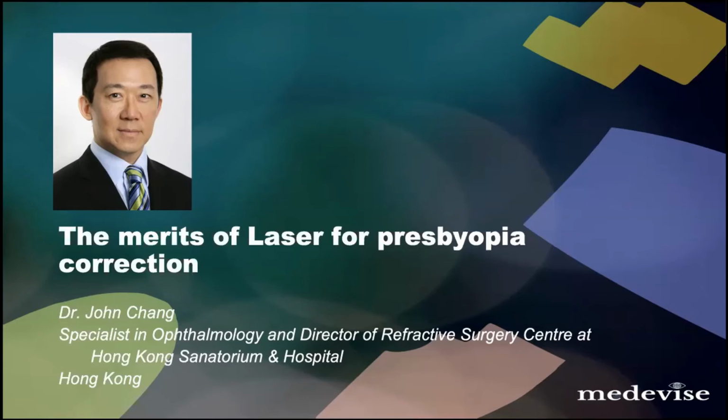These are for the presbyopes, so that they can see the computer and they can see near. With the distance eye, it depends. If the patient needs very good distance vision, then I just do a standard aberration-free type treatment. If they're mostly near, then I would consider doing that eye with the increased depth of focus as well, Q adjustment.